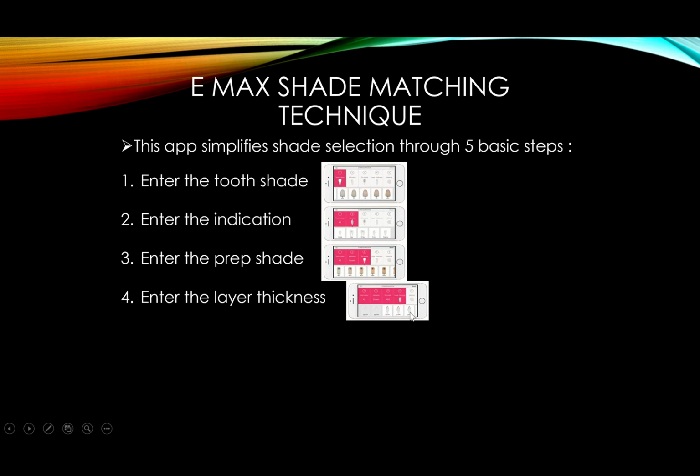And this is important. This is really important. We're going to show an example about it. The thickness is 0.5, 1.0, 1.5, whatever. The buccal thickness, of course, of the prosthesis. And enter the material. What are you going to use? So you can see that the first 4 I need to get from the dentist, or I need to take my own photos or my own readings, but it's a clinic side thing.